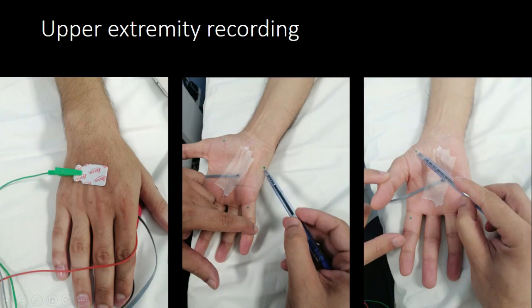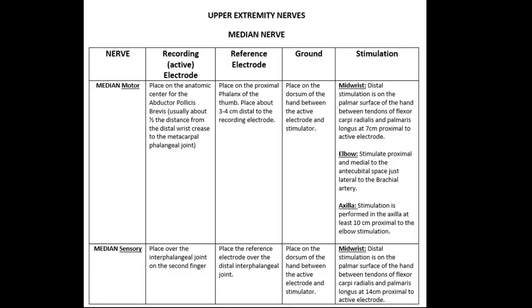But for the students and residents and fellows, I will really prefer that you mark it when you examine. I tend not to use the red marker because it feels like you poke the patient everywhere and the patient is bleeding.